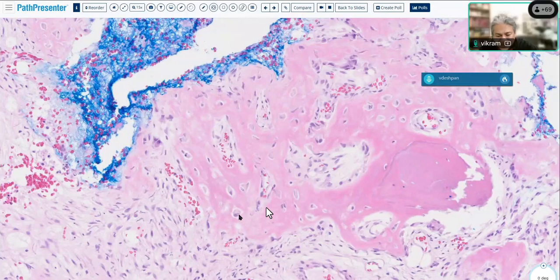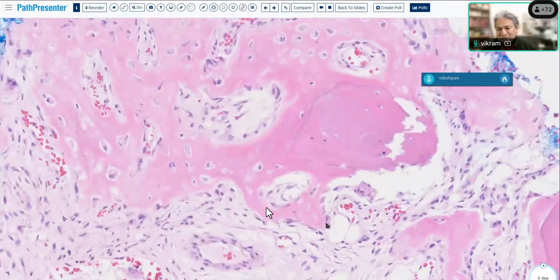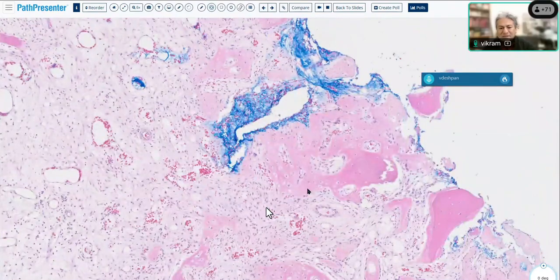The osteocytes almost look like osteoblasts. In fact, the osteoblasts get embedded in the bone and get converted into osteocytes. So you can see these cells have a lot more cytoplasm. They almost have this eccentric cytoplasm that is associated with osteoblasts. They almost look like plasma cells, don't they? And you can see that it's woven bone, loosely, almost a little lace-like deposition with absolutely no lamellar bone. Here along this side, you see more prominent osteoblasts. And the one thing you'll notice is that most of the woven bone, in fact, all of the woven bone gets deposited.